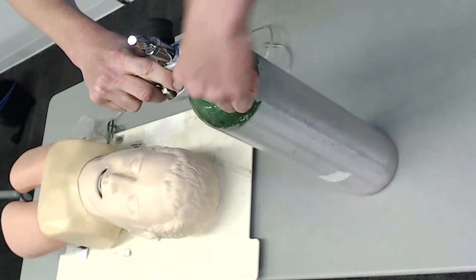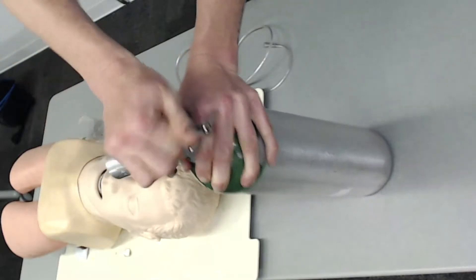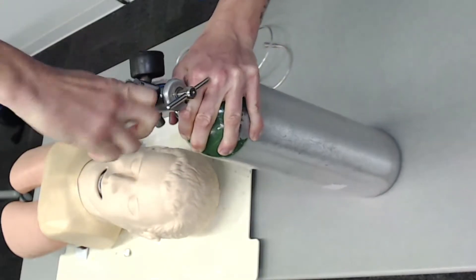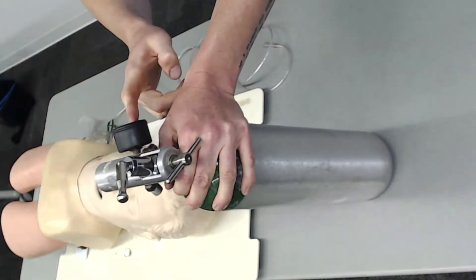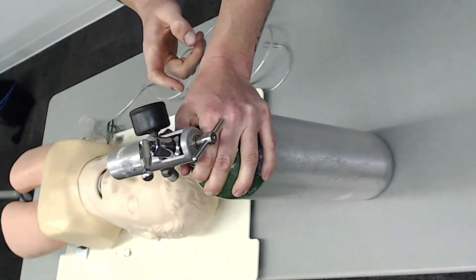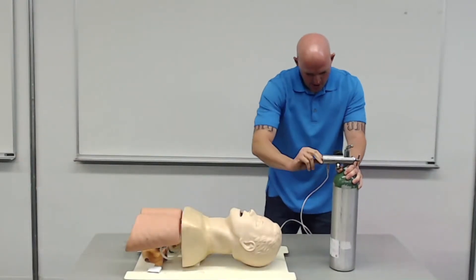Now I'm going to open it and look at my pressure. We've got about 1600 psi in this one. I'm going to grab my non-rebreather, plug it in, and turn this to 15 liters per minute. I know I have no leaks before I start.